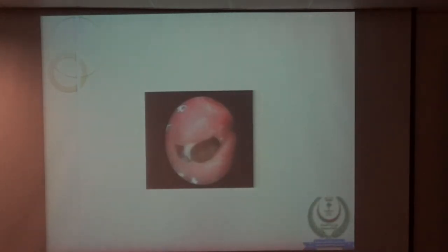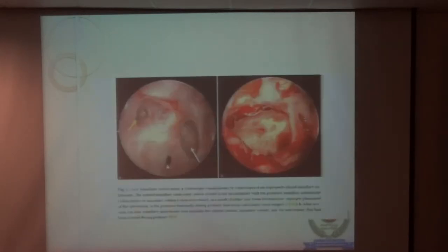Variation in the middle turbinate is very important to look for to have good drainage and a good middle meatus antrostomy. The presence of an anterior fontanelle or posterior fontanelle is a very essential part to deal with during the surgery. We have to communicate those openings with the natural ostium, so we have a good and clear opening, and it will help in the drainage.